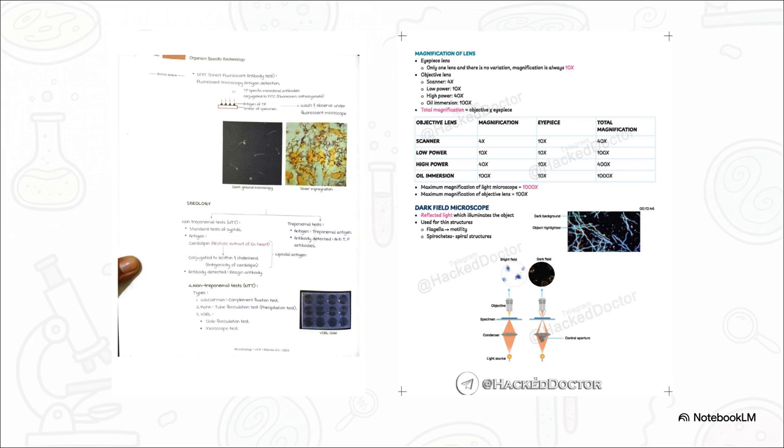And the result of this dark ground microscopy? We can actually watch the living, moving, bright spirochetes as they spiral and flex against a stark black background. It's a really brilliant workaround.